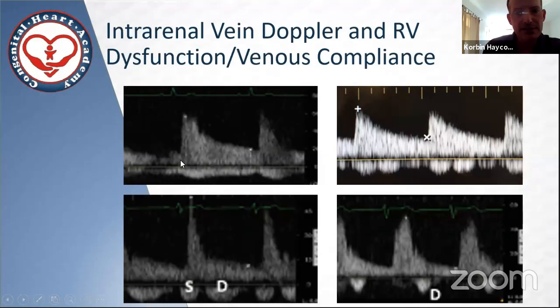This is the baseline, and the small arteries are traveling anti-parallel to the small veins that we would be interested in. Above the baseline is the arterial flow coming towards us. From the difference between the peak velocity and end diastolic velocity, we can calculate a renal resistive index, which we're not going to talk about today. Just know that the bigger the difference, the worse the microcirculation probably is in the kidney.